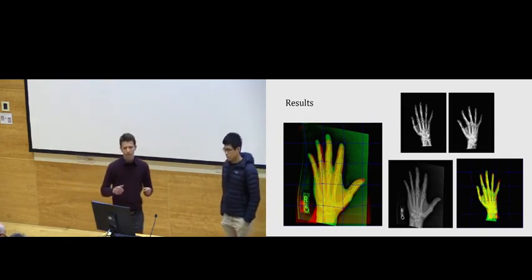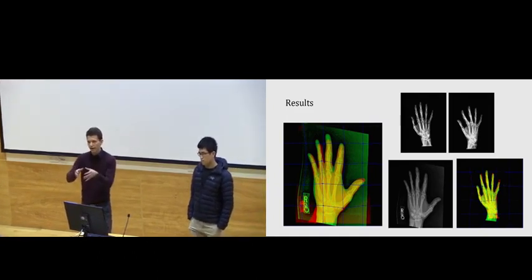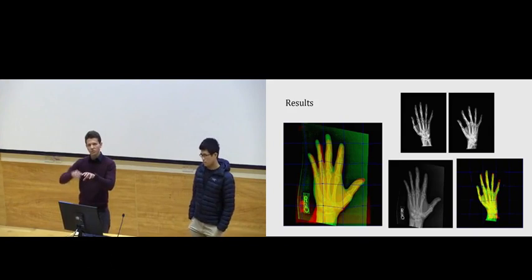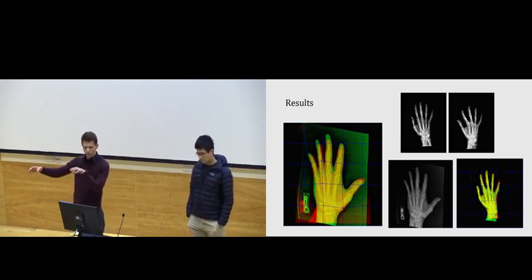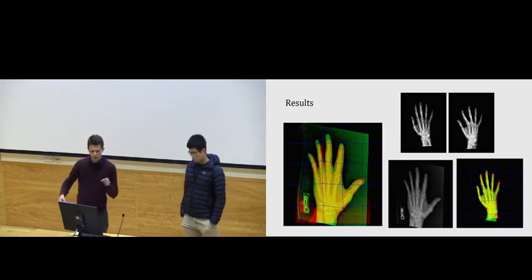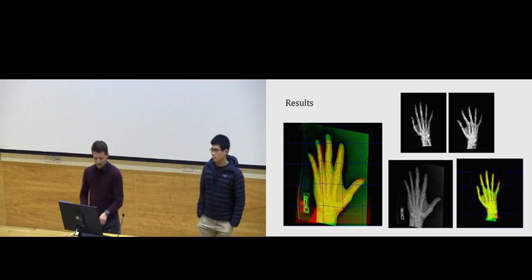And this allows the radiologist to look at one part of a bone and actually have it compared to the same part of the same bone with other patients who had the bone healthy. So this is something that we consider to be most helpful.